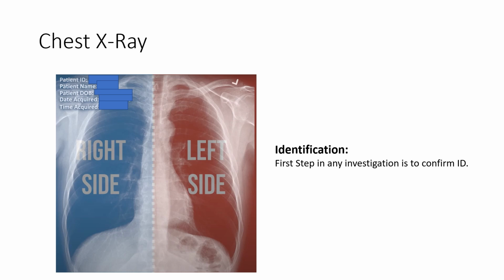Time on which an investigation has been done is also of paramount importance to ensure whether an investigation has been done in relevant time frame. Patients sometimes show old X-rays instead of fresh ones in hurry. Old X-rays are also significant. Check old X-rays for comparison to look for any acute issue.